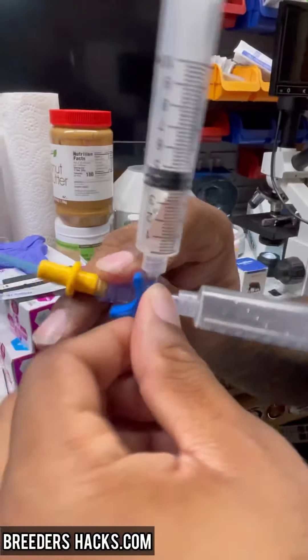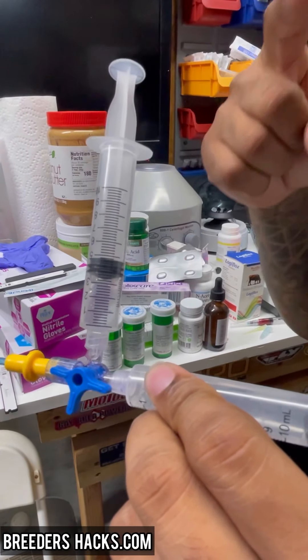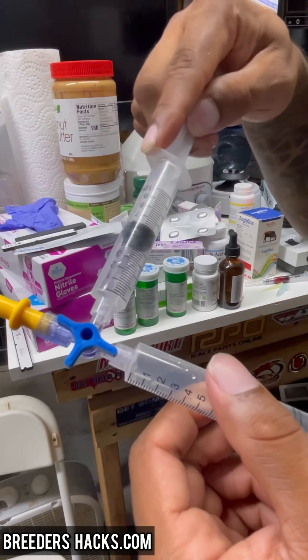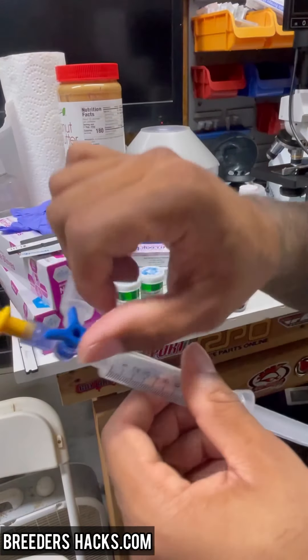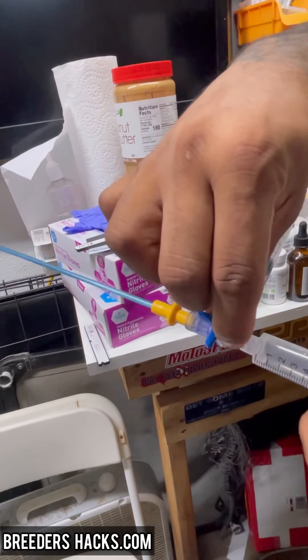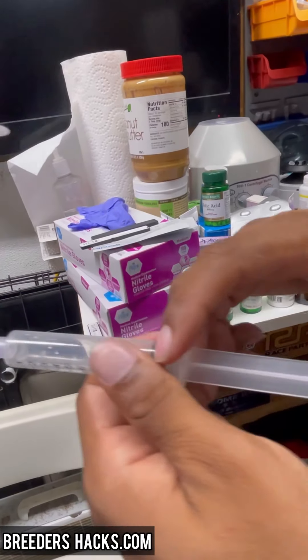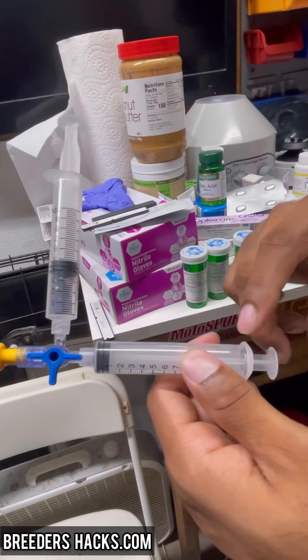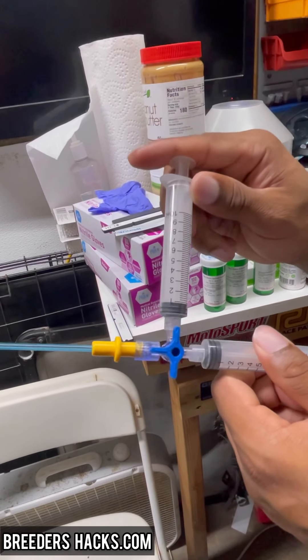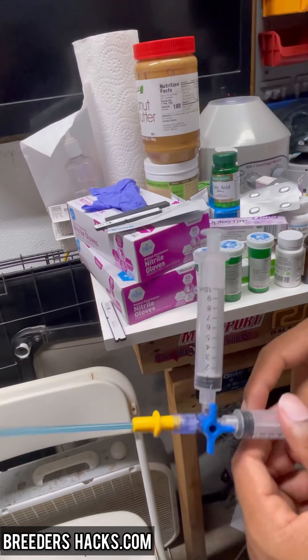There are three stops. You set it to the first stop like this. Make sure you have the semen loaded at the bottom and the air pulled before you get started — at stop one you can't draw any more air out. Once it's inside the female, push the collection through. Then set it to stop two, where you flush the air out of the pipette. Stop three is where you close off the pipette so nothing can come back in.